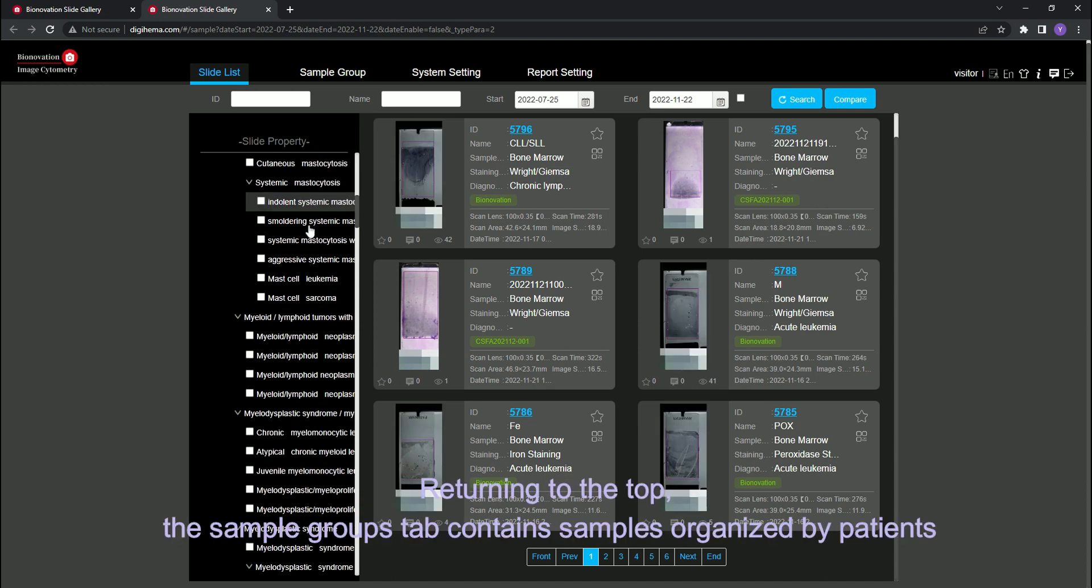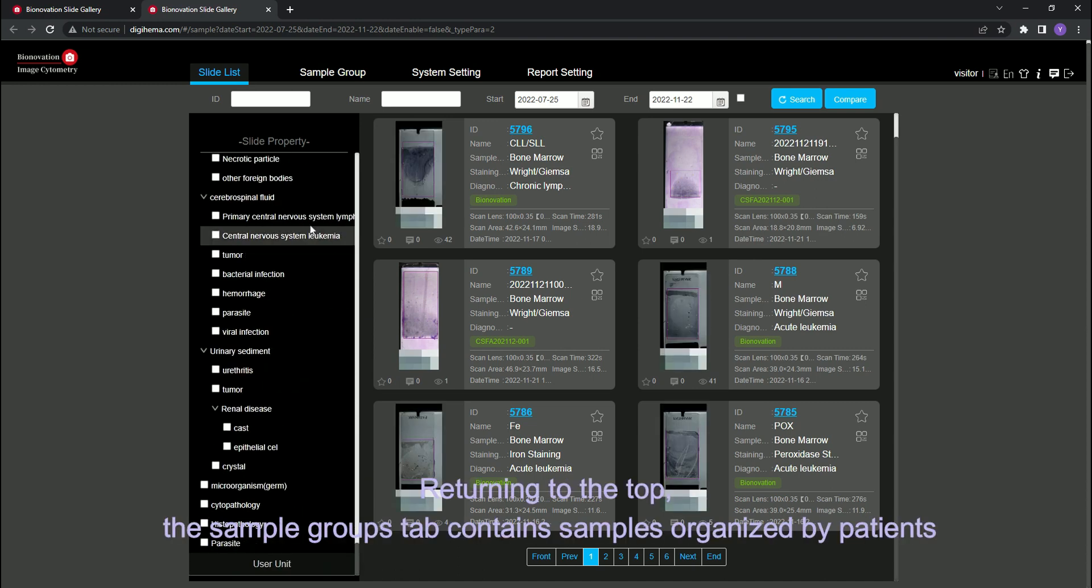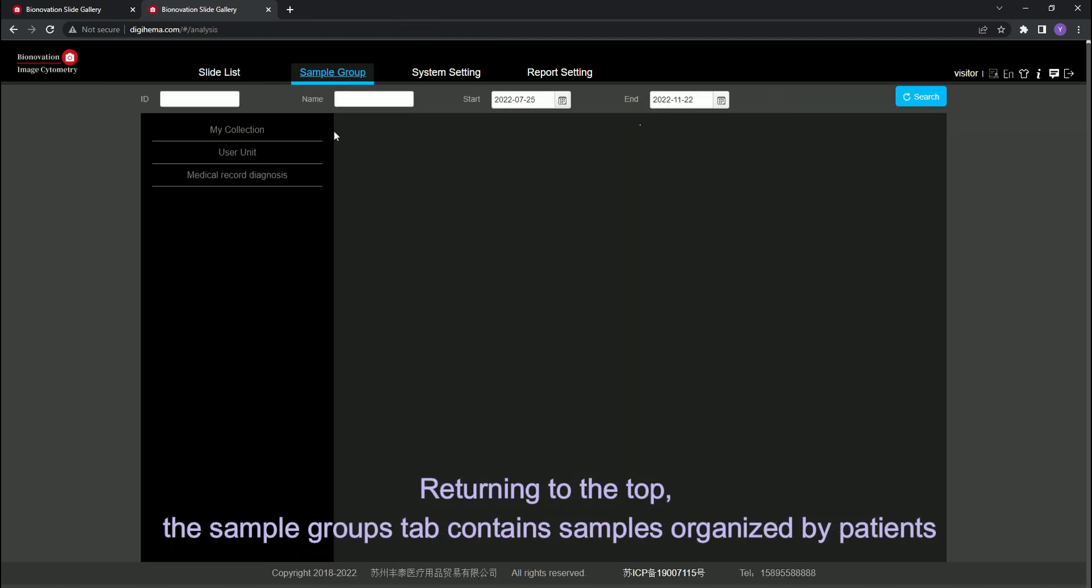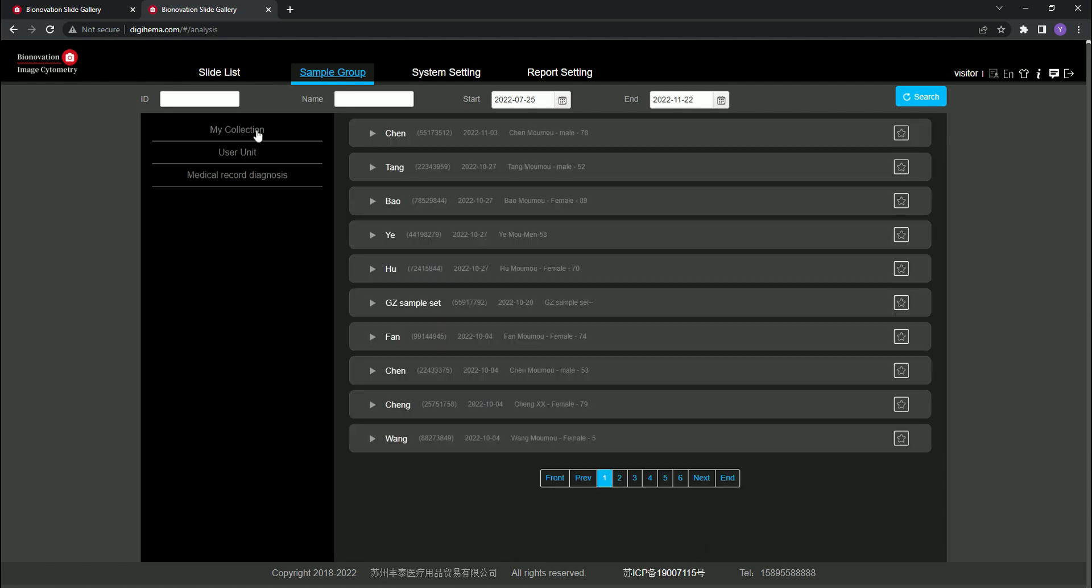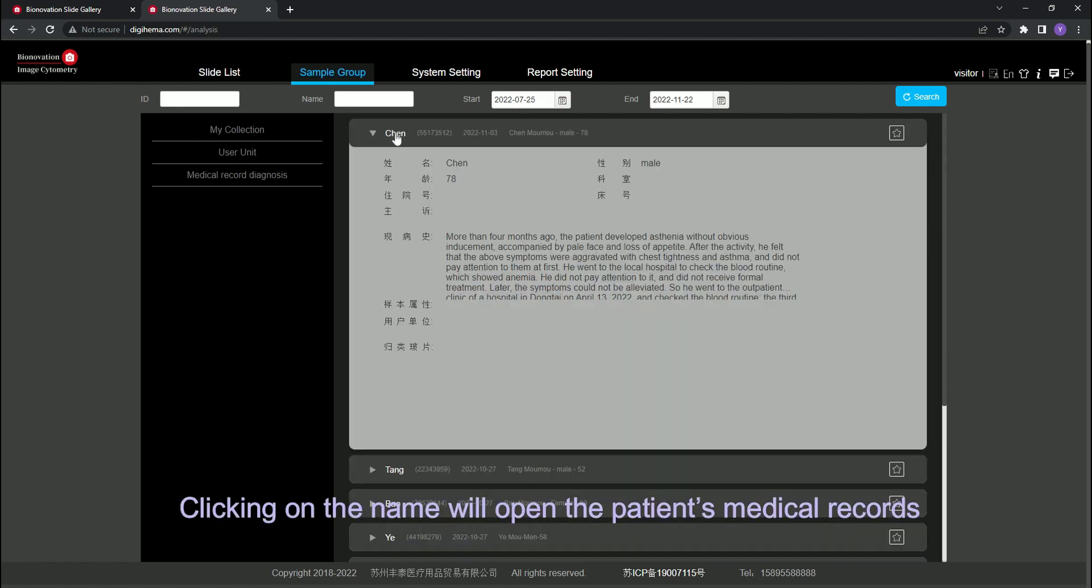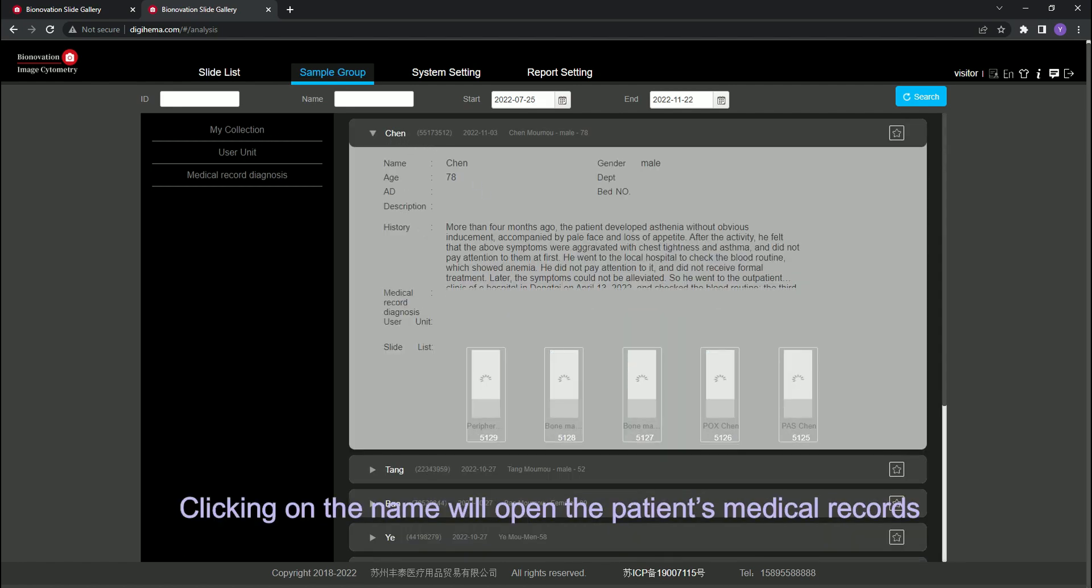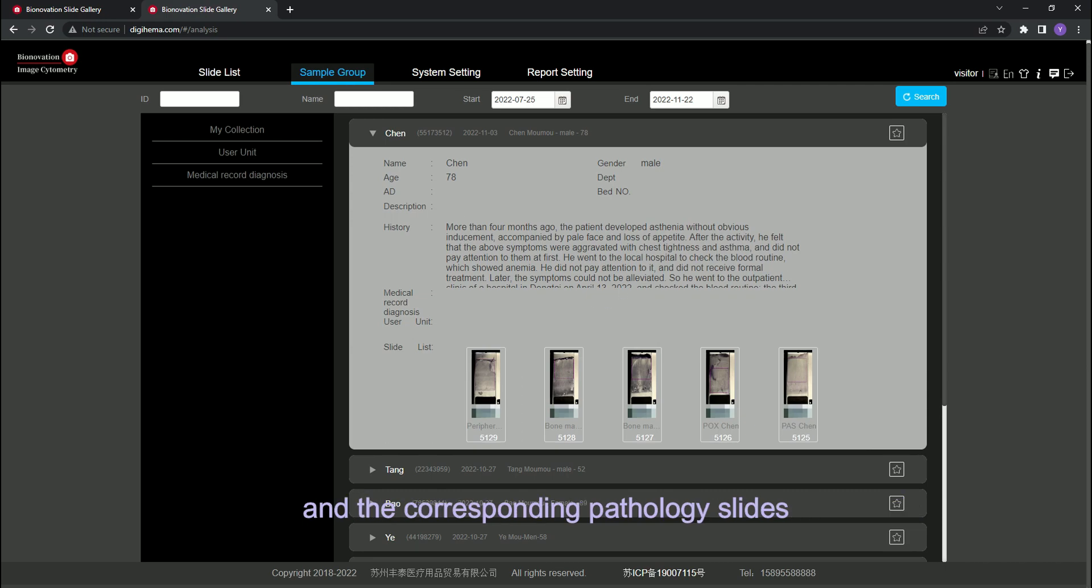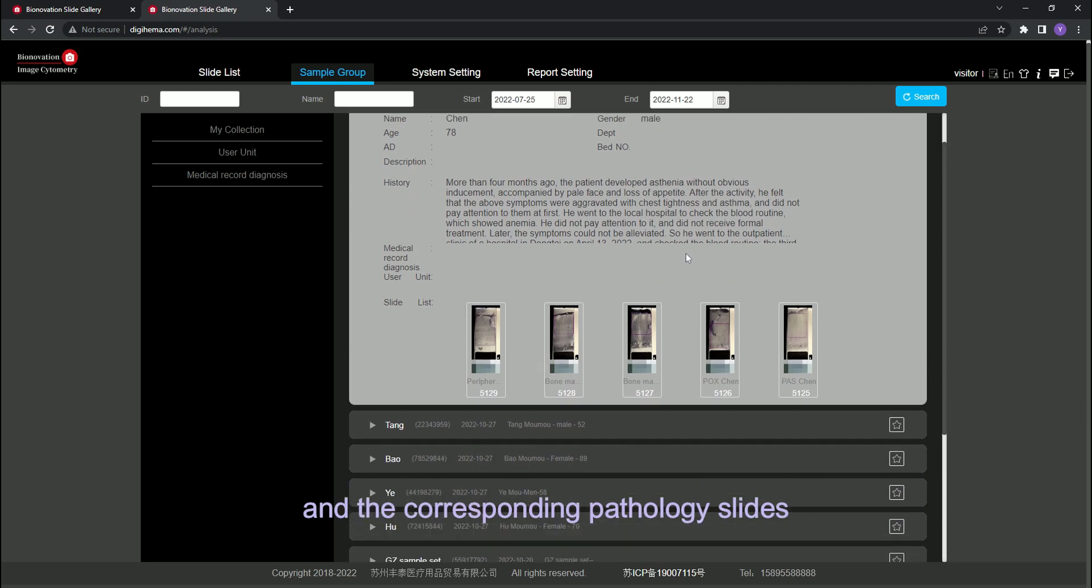Returning to the top, the sample groups tab contains samples organized by patients. Clicking on the name will open the patient's medical records and corresponding pathology slides.